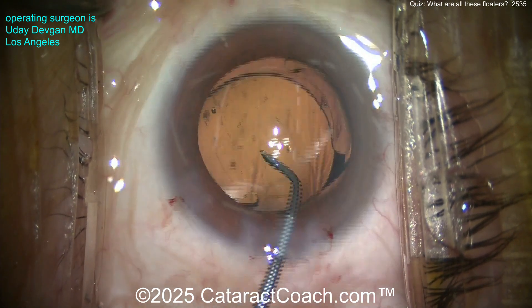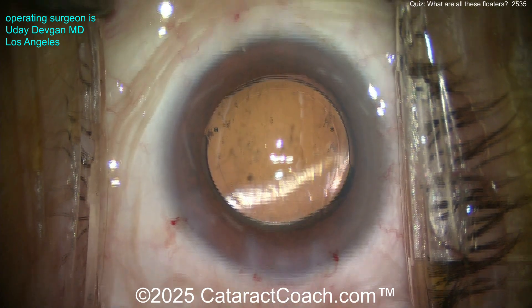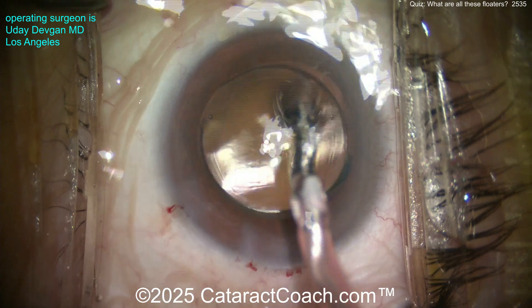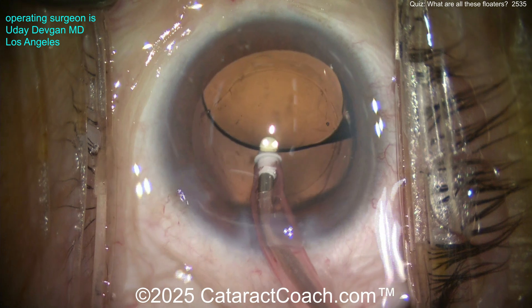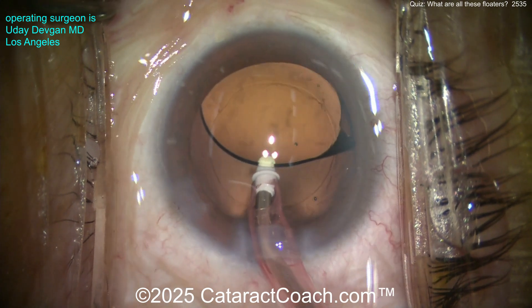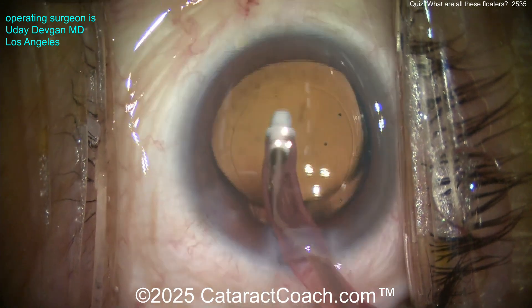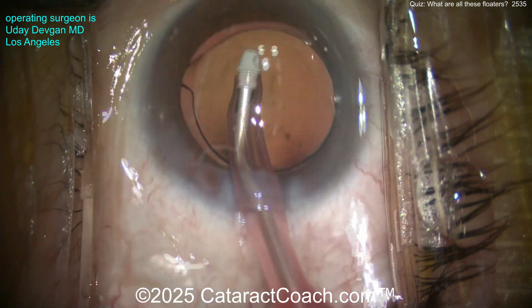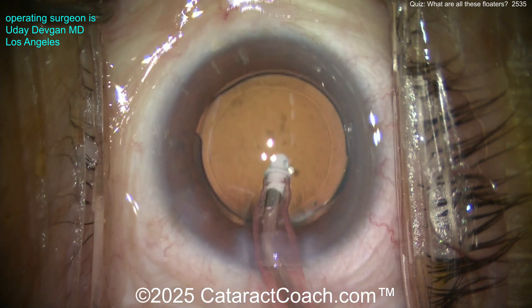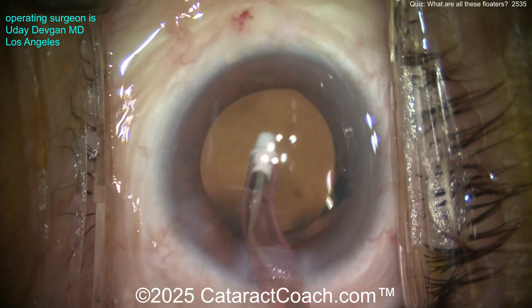The key you saw at the beginning was loose zonular support. When I poked into the lens capsule for the rhexis with those forceps, you saw the radial wrinkles. And then even as we did the capsular rhexis, you saw more wrinkling of the lens capsule than you should. You want that lens capsule to be tight and taut, meaning the zonular support is really strong — but that's not the case here. This patient has no prior trauma.